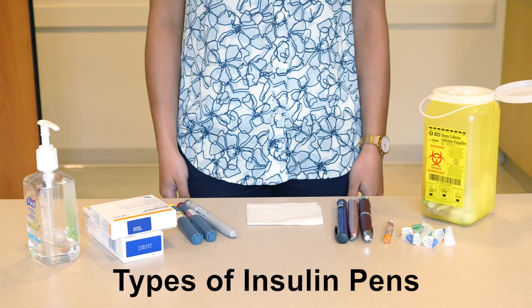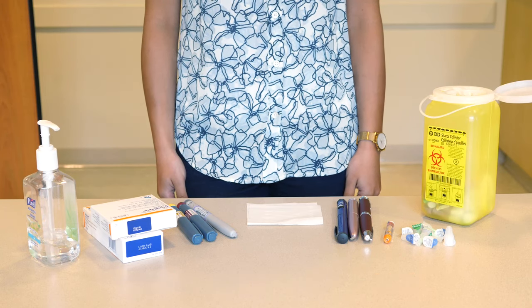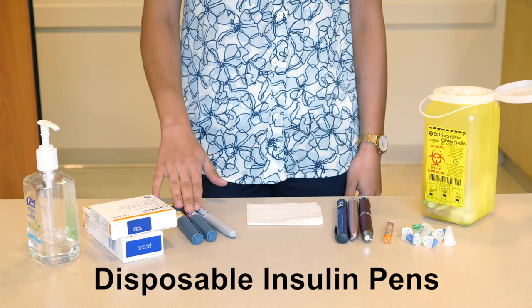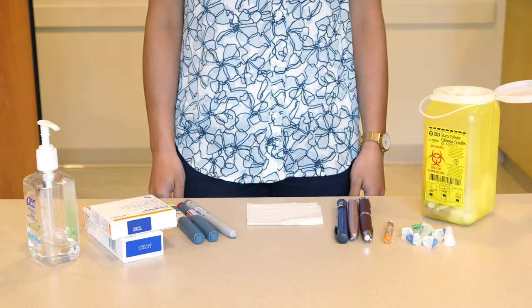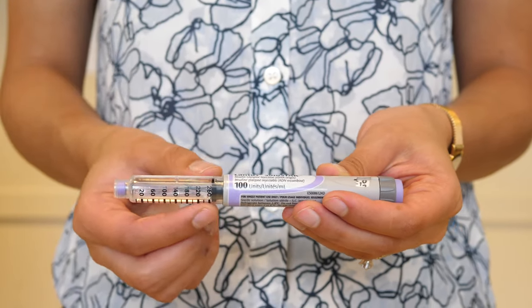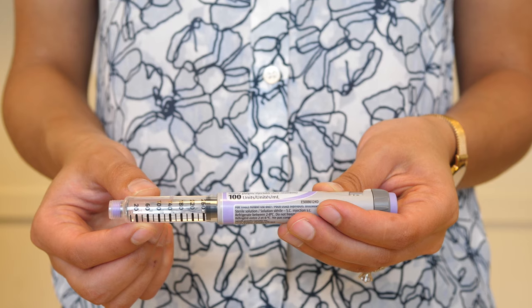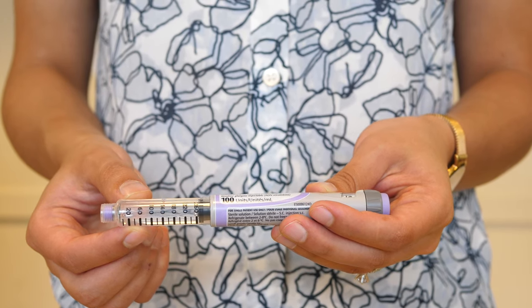There are several different types of insulin pens. Some insulin pens are disposable, with the insulin already in the pen. There is a plunger in the pen. Once it is at the end of the pen, you will need to use a new pen. Once the pen is empty, you can throw the whole pen in your recycle bin.